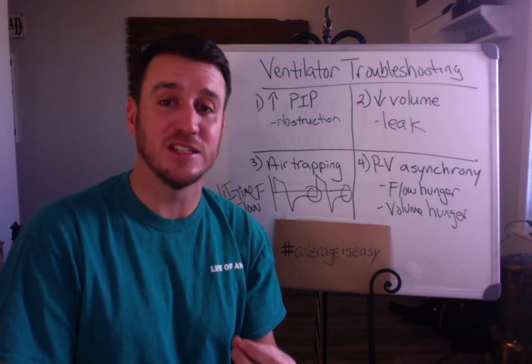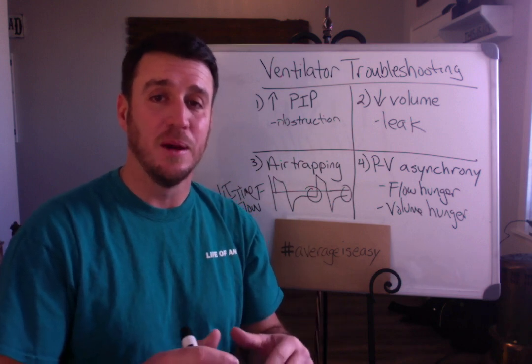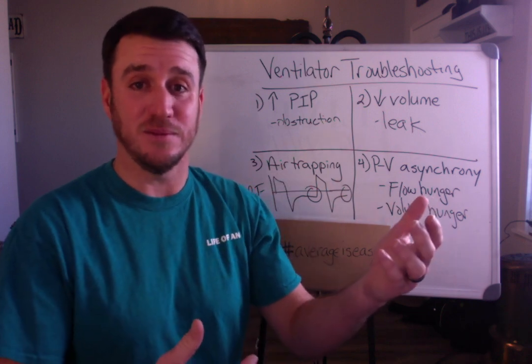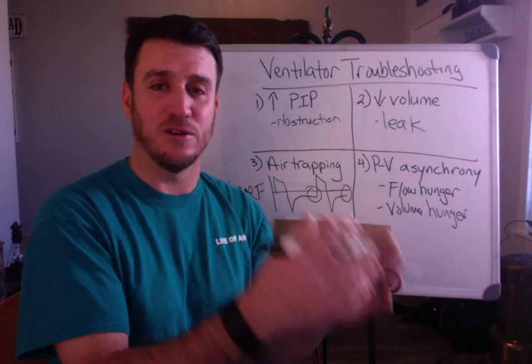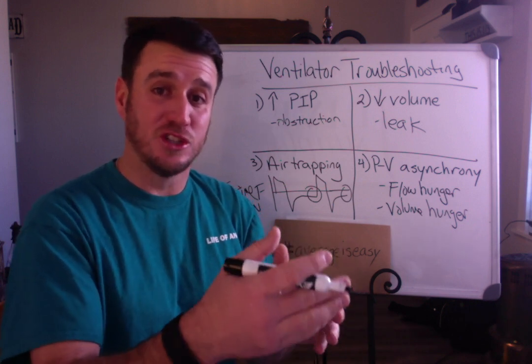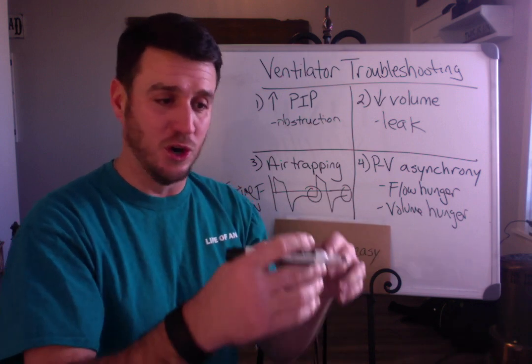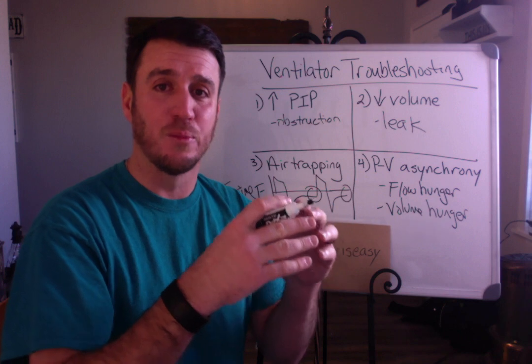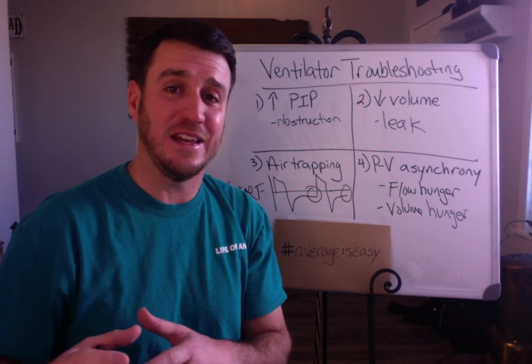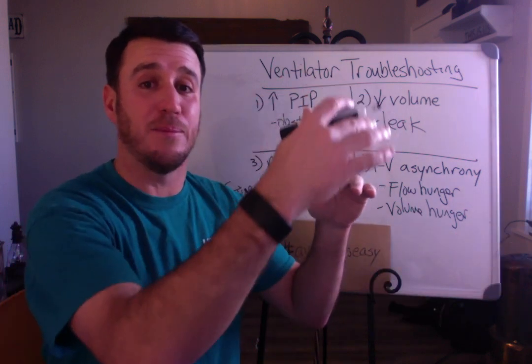This patient is obviously not comfortable. We're trying to do low volume ventilation, but in reality, we're actually doing high volume ventilation. Let's say they're on a tidal volume of 400. By the time they breath stack, two consecutive breaths, they're actually receiving 800 mLs. So a concept that's supposed to be around preserving and preventing barotrauma is actually leading to just that, because you're stacking these small tidal volumes on top of one another.